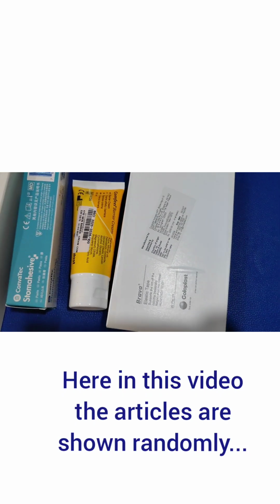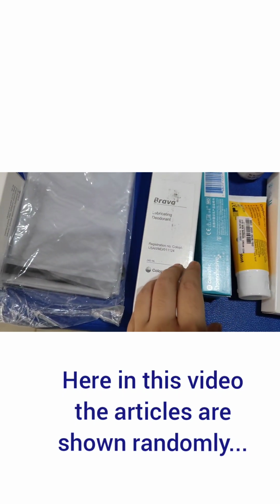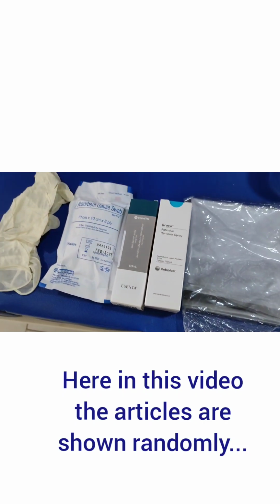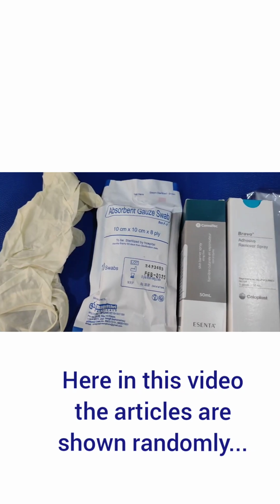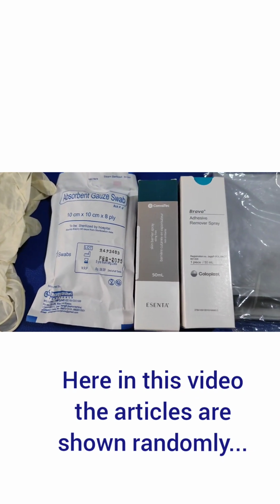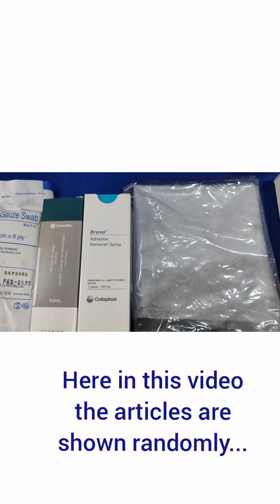Then stoma powder or paste for leaks, for irregular skin, and for the stitches side, the stoma powder can be used. Then skin barrier wipes or protective film are used for maintaining the integrity of the skin. Then disposable gloves for the procedure.